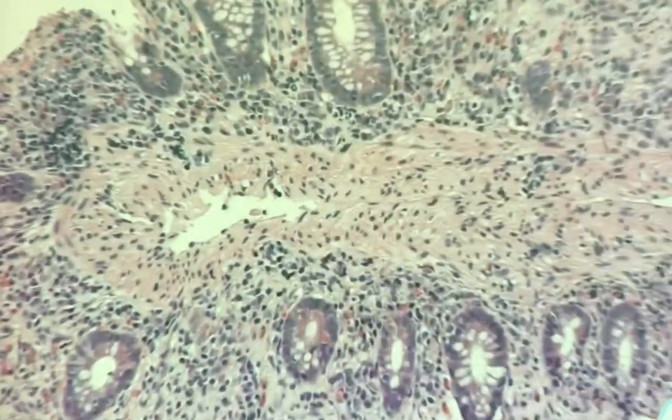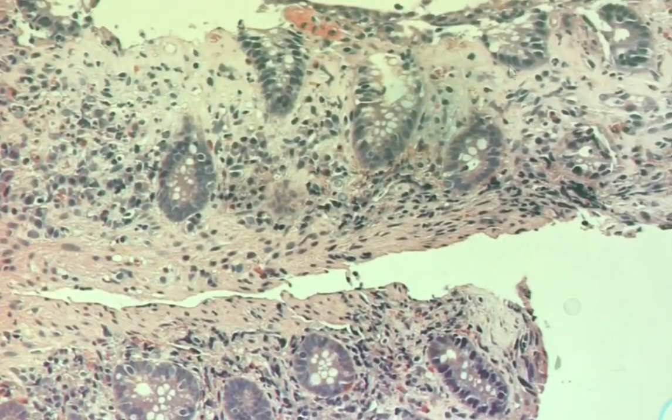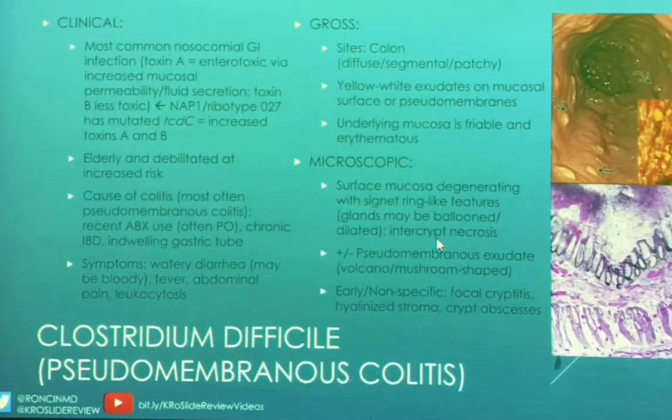Okay. So it's just this last piece. And again, we're starting to see a little more ballooning degeneration, this collagen deposition that's kind of entrapping inflammatory cells. And we're going to pick up speed a little bit after the mouse hiccup.